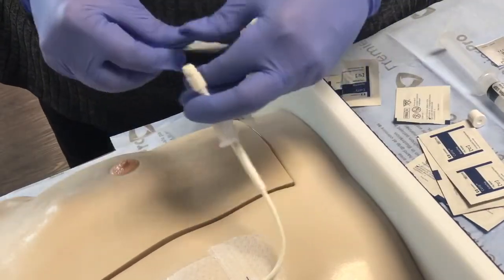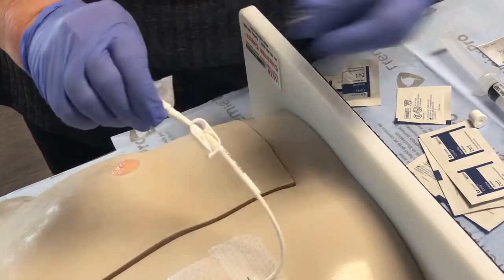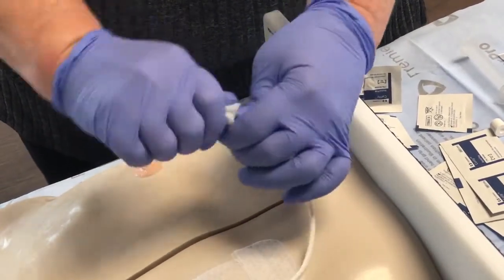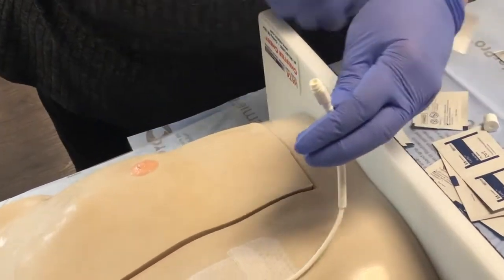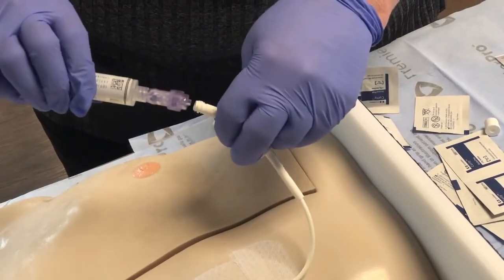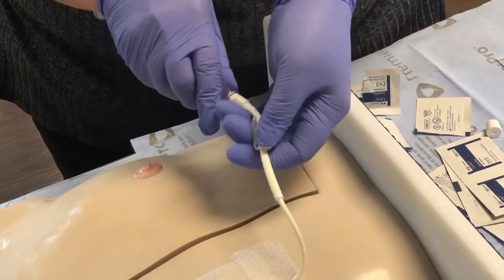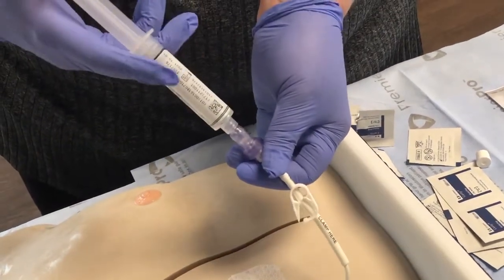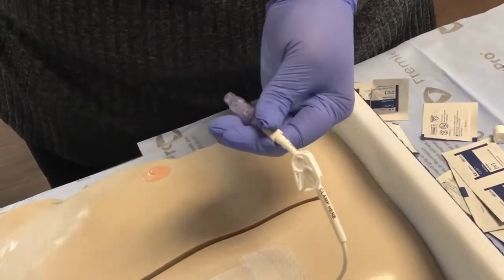Scrub the exposed end of the catheter for at least 15 seconds and allow to dry for 60 seconds. Attach the new primed hub. Unclamp and flush using the pulsatile method. Remove the syringe and clamp.